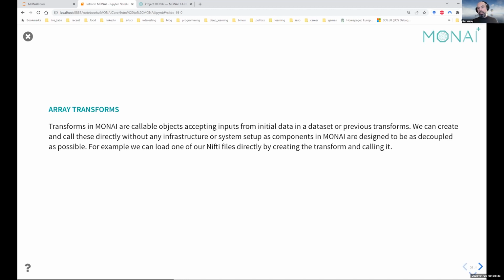If you are doing semantic segmentation, for example, then you might just train exclusively on crops of your data because the memory requirements are such that you cannot load the whole thing. People often will take data that's heterogeneously sized and resample it into a common pixel space. So there's many different ways that you might tackle that. Those are several of them.